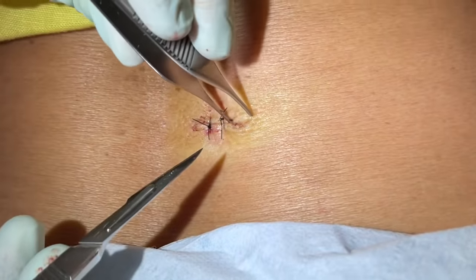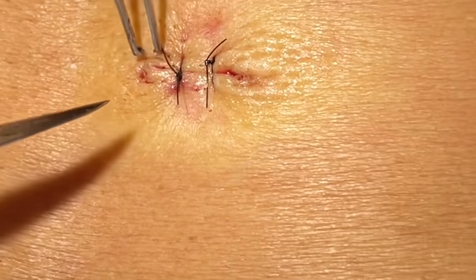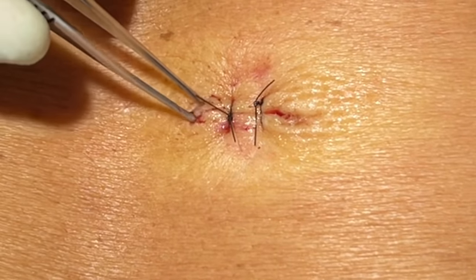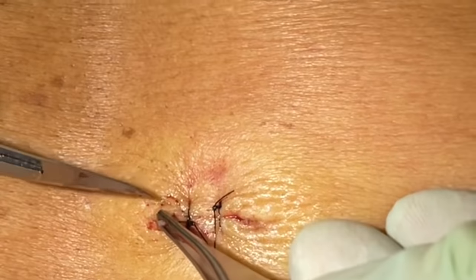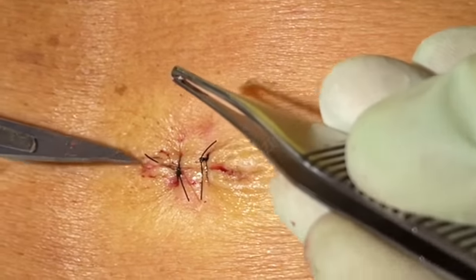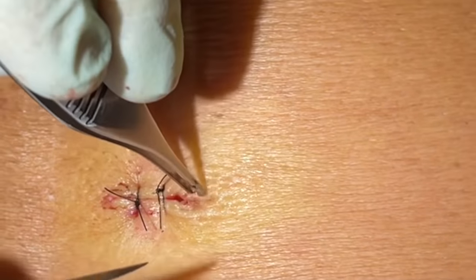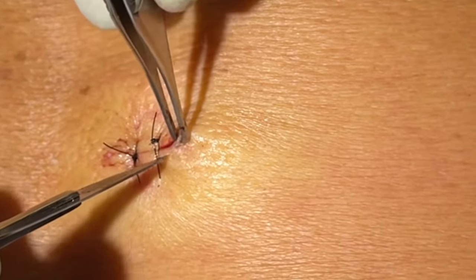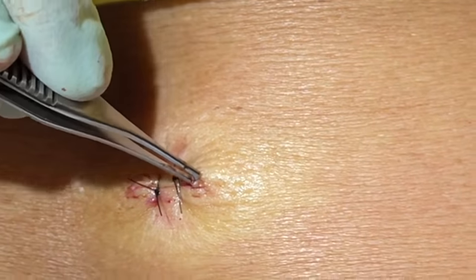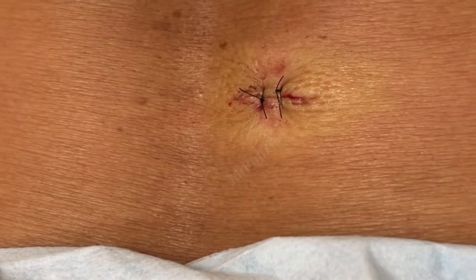Anytime we do an 8mm punch, it's a circle trying to close. So sometimes you'll get a little dog ear like this at the end — I don't leave those. We just make a little cut. You can see this little triangle folds over right there and you just cut that at the base, and you get that little dog ear off of there, and then it closes flat. We'll do that on the other side as well — cut at the edge, take that little triangle, cut straight across just like that. So that'll be a nice flat scar.